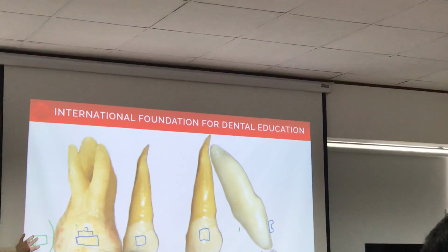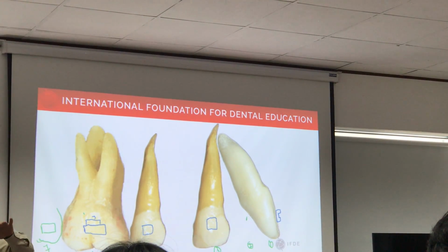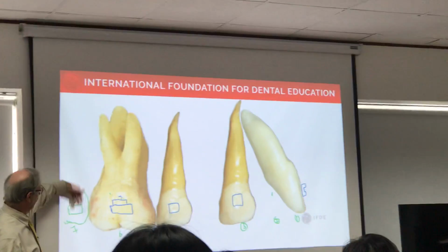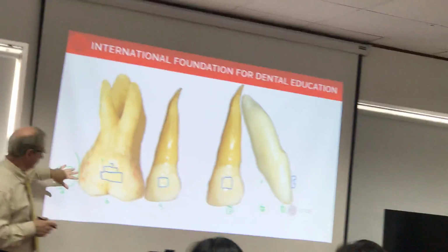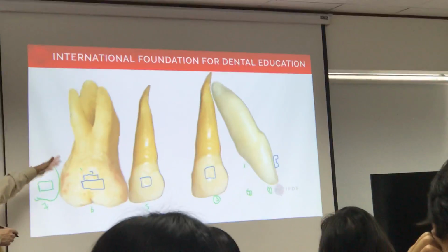Adding the 7 is a good idea. Even if it's not, you don't want to waste too much time. If it's like tip back and this and that, you may just put this passively so you can just put the tooth in the anchor. You don't have to align everything.